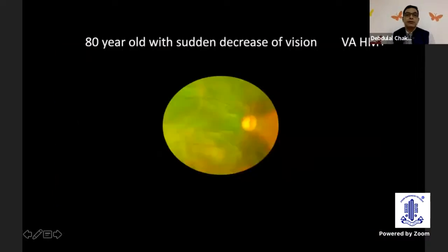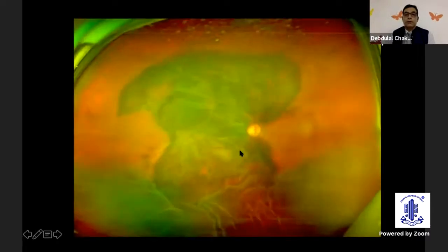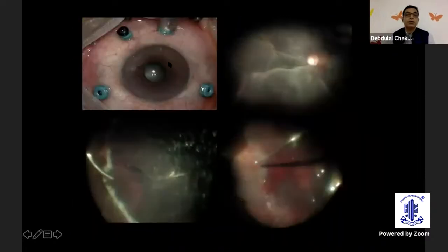Let's look at this. This is an 80-year-old gentleman with sudden decrease of vision. The visual acuity was hand movement. And this is what our conventional fundus camera would show us. But if you look at the Optos, the whole story is actually in front of you. So we have a very, very large subretinal hemorrhage, and of course, exudative retinal detachment. And all this was captured through this small pupil.